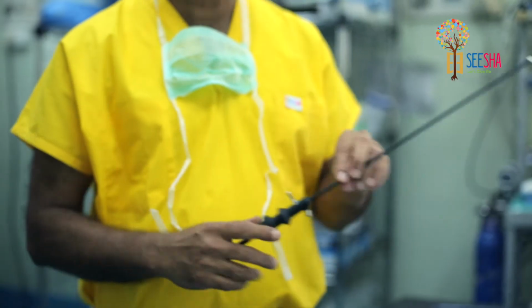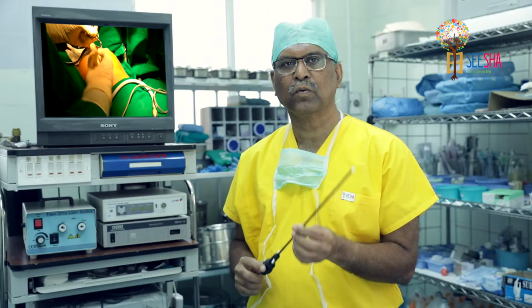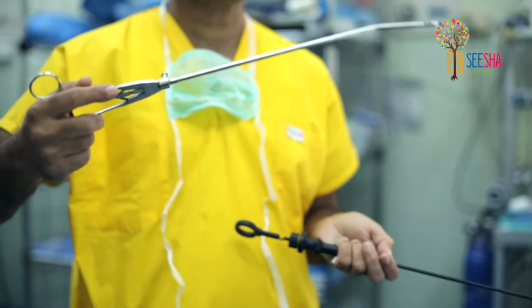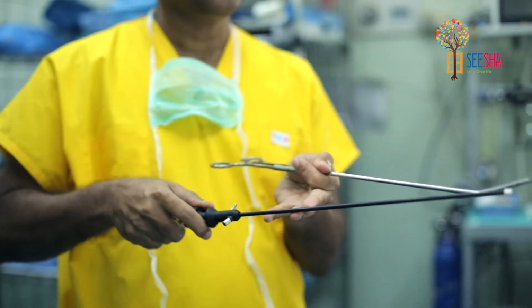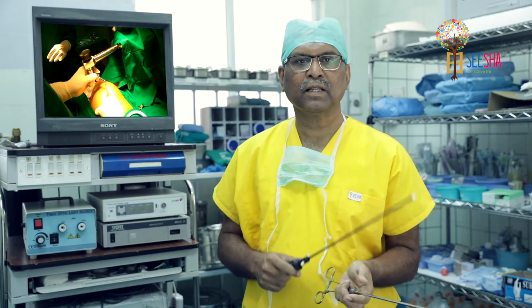However, the most common instrument that we use is the puncture needle we use for puncturing the ovary in polycystic ovarian disease. We use a grasper like this, which obviously cannot be used during conventional laparoscopic surgery, to hold the ovaries up, and then we make multiple punctures. In Mizoram, during the last 1 year, we found that almost 40 to 45% of the patients on whom we had operated had conceived during the last year.